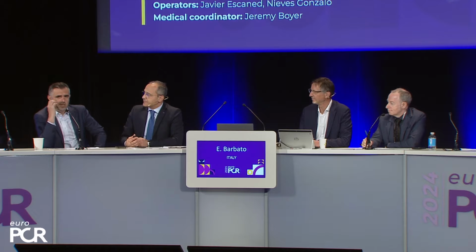So usually in my practice, if I cannot cross the imaging device, and it's calcium, then I'm very quick with an ablating technique. So you could use rotational atherectomy traditionally, or you could use orbital atherectomy. In my earlier years, I was playing a lot with balloons, doing 1.0, 1.5 to 2.0, but I stopped doing that. I now progressively move to an ablative technique and then cross the imaging device and then continue.